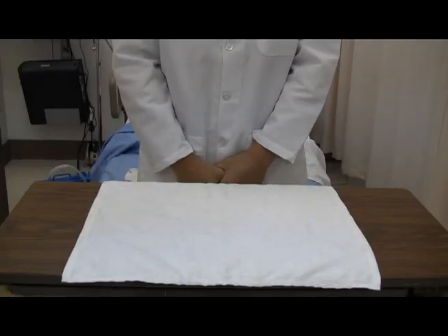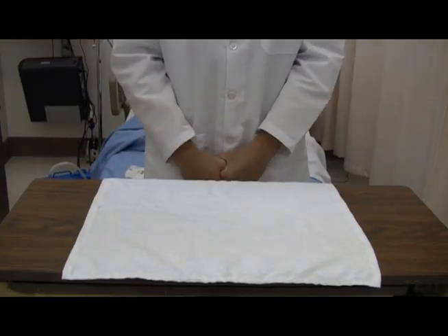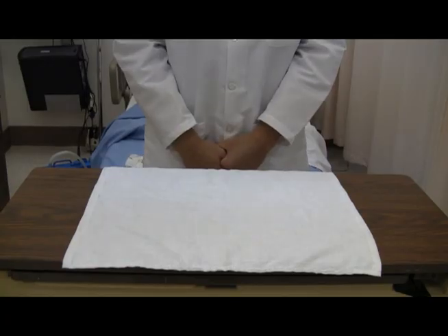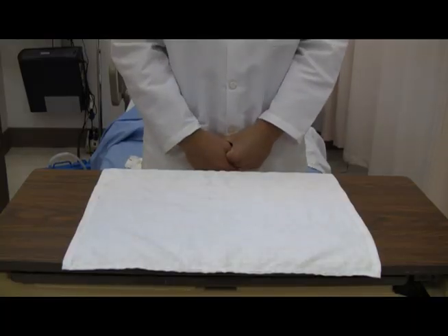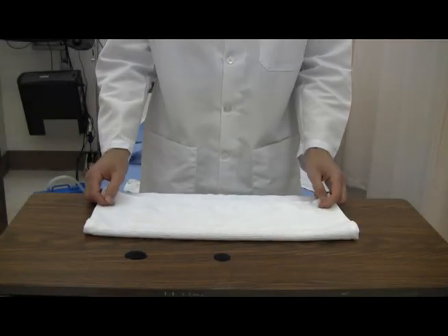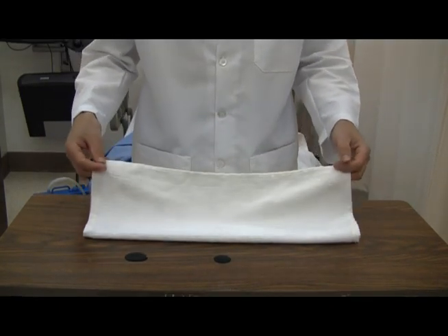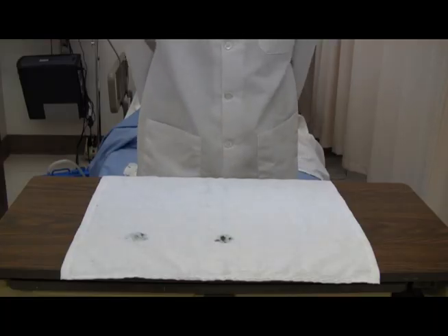We said that it doesn't matter if your sterile towel is blue or white, but in this case I'm using a white one to demonstrate why it's important that your table is dry. This towel is placed on a dry table and it looks like we've maintained sterility. Now I'm going to show you what happens when we place it on a damp table. So if we had placed this towel on a damp table, even though this is a bit of an extreme, you'll see what would have happened. Anything that was on the table is now on your towel and probably on the dressings that you are going to use on your patient.